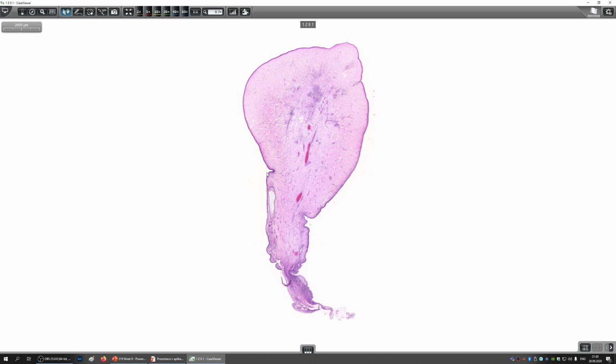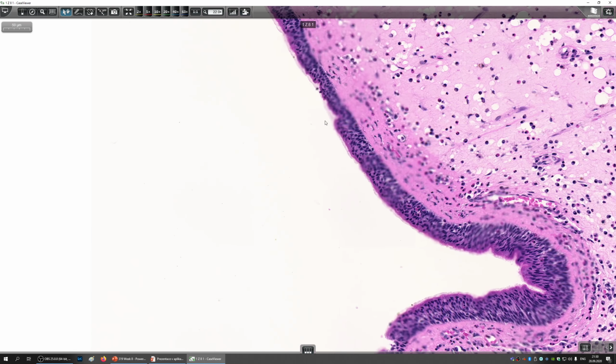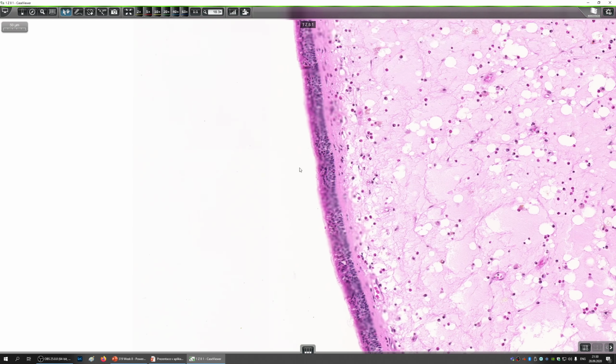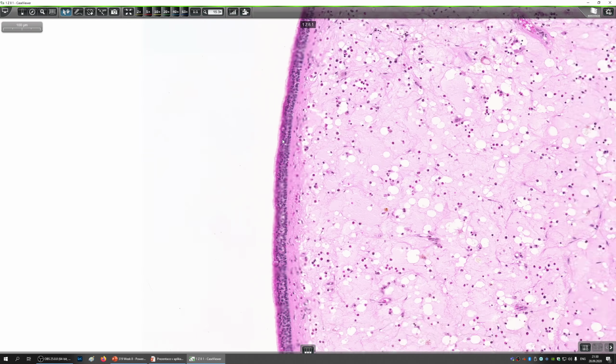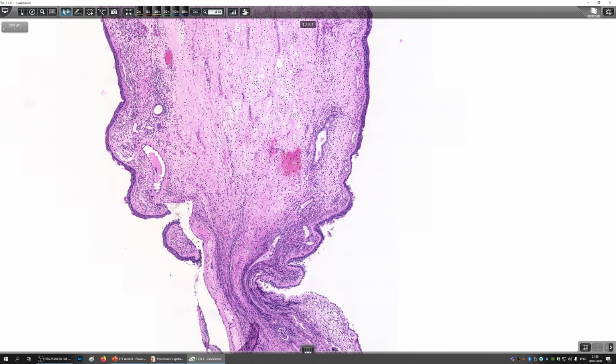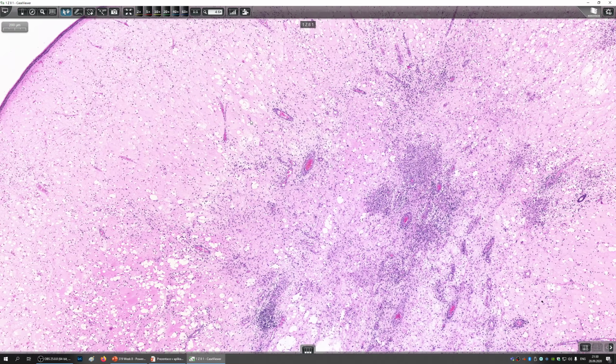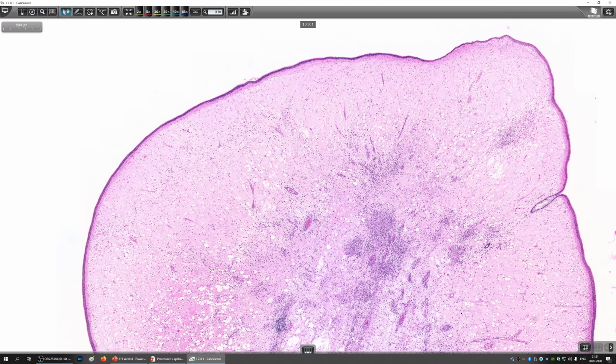Now let's have a closer look at it. We check out the surface epithelium. Here the surface epithelium is ciliated respiratory epithelium, multi-layered. Here are the cilia. Sorry for the strange section. It's a bit thick. In the previous case, in week number 2 or 3, we also had areas of squamous metaplasia, which unfortunately we don't have in this. But what we have a bit more prominent is the edematous stroma. So here we have basically interstitial edema of the stroma.